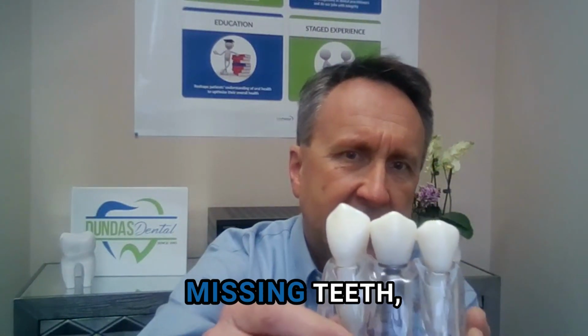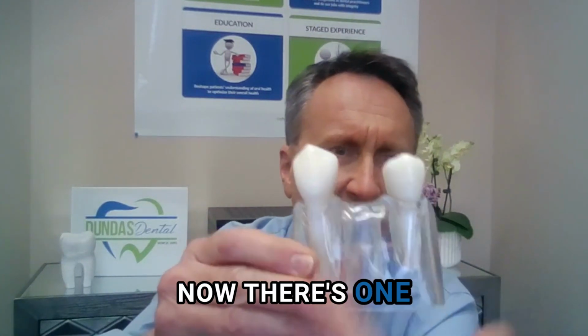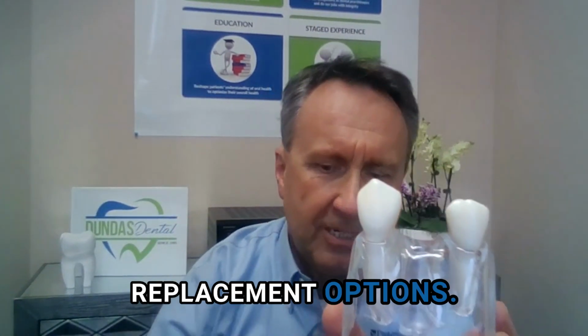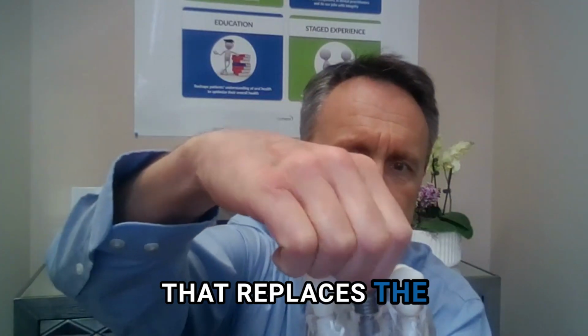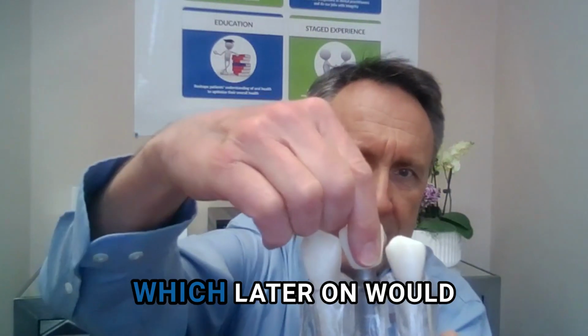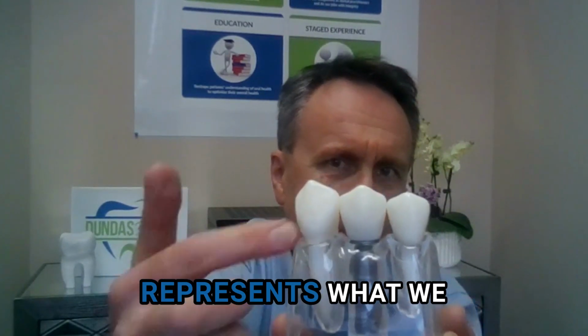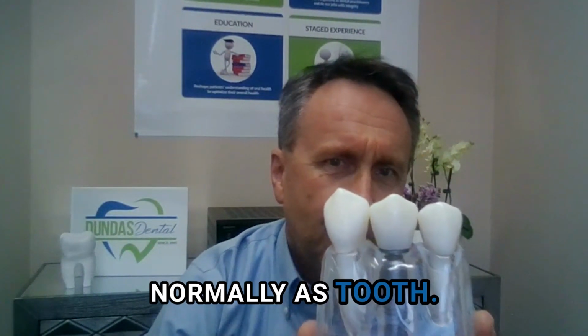So if you have missing teeth, let's look at this thing here. Now there's one missing tooth right here. There are different replacement options. In case the best replacement option that replaces the natural tooth would be the dental implant, which later on would be restored right here with a crown, which represents what we see in the mouth and we refer to normally as tooth.